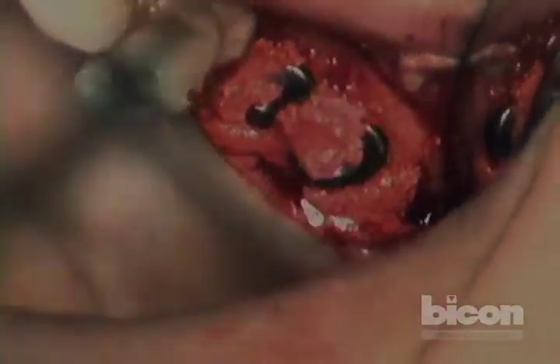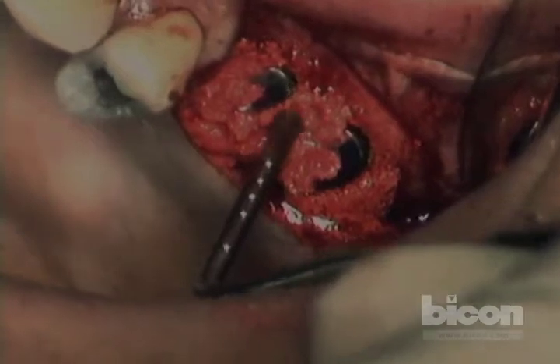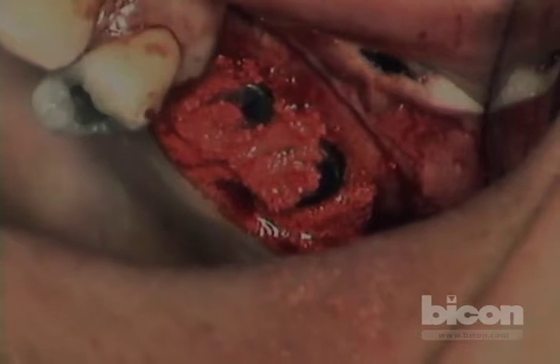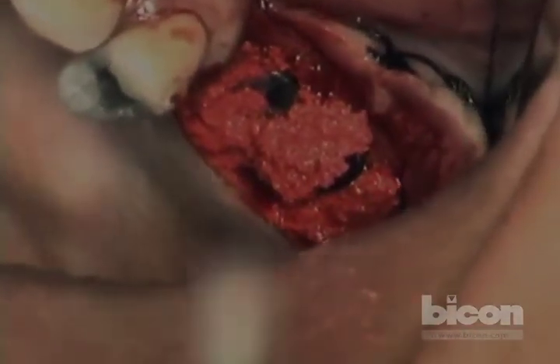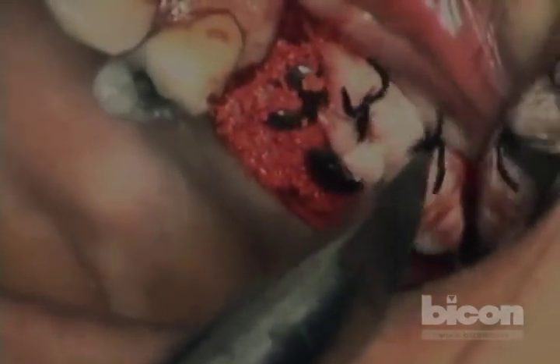I'll use the shoulder depth gauge — it works very well as a condenser. We'll pack graft in between and also put some more bone in the back, making sure the shoulder is covered. We want to make sure we didn't overfill it and that there are no points of pressure. Then the idea is to close it as gently as possible. We're going to remove the sutures now and take a gut suture to close.